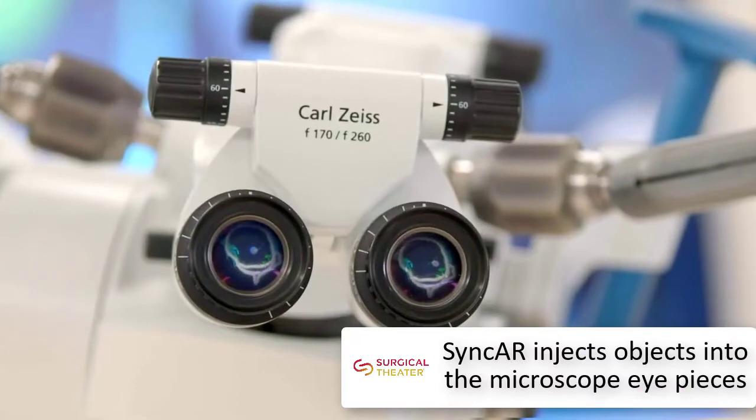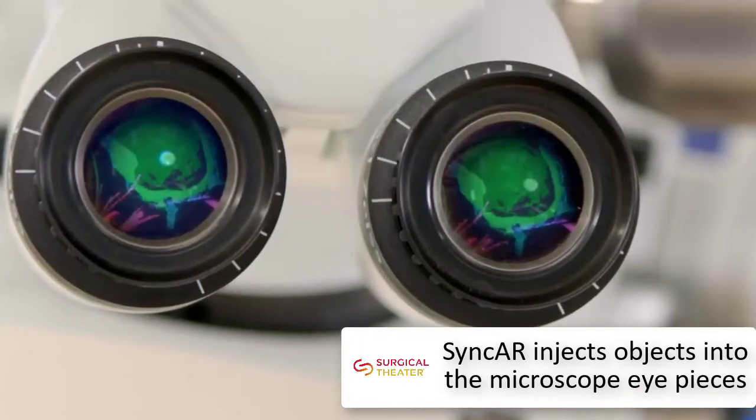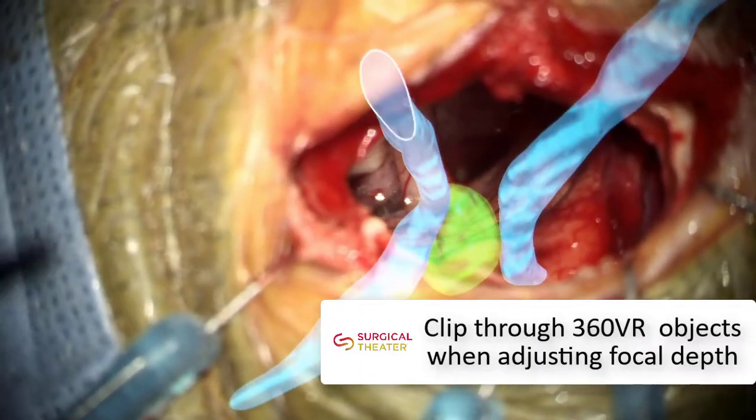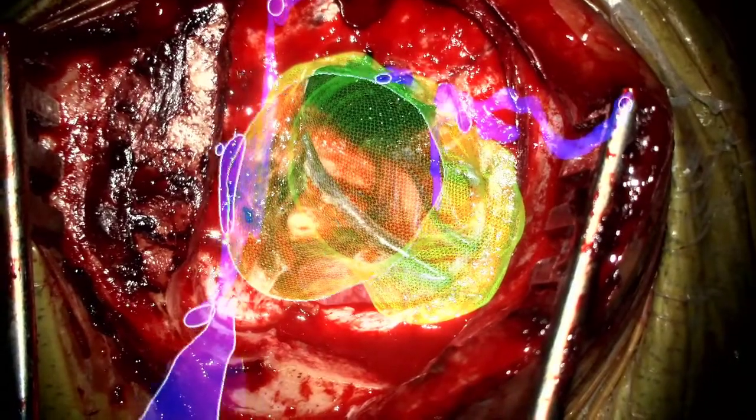The microscope's heads-up display can project Sync-AR overlaid structures during live surgery. As the surgeon adjusts the focal point, Sync-AR automatically clips the rendered image to show only what is relevant at each depth level.